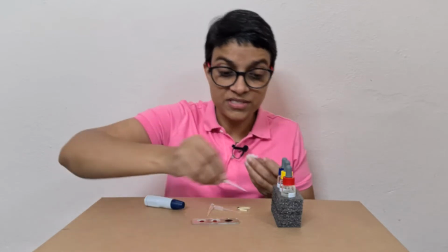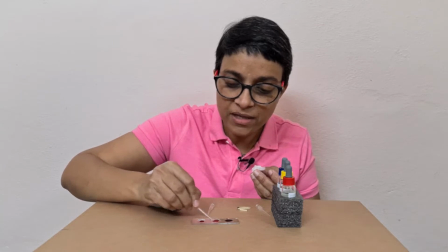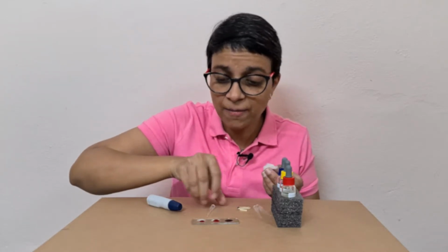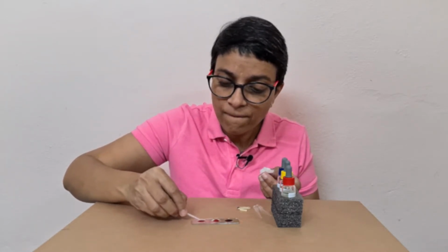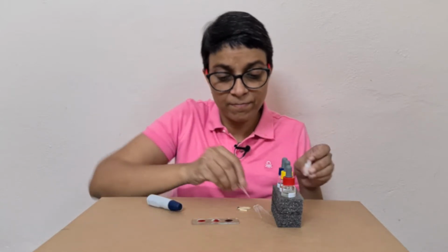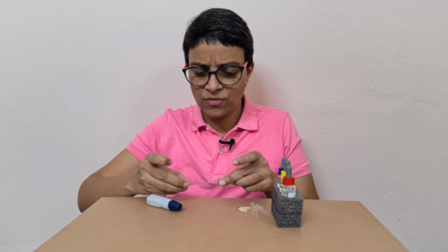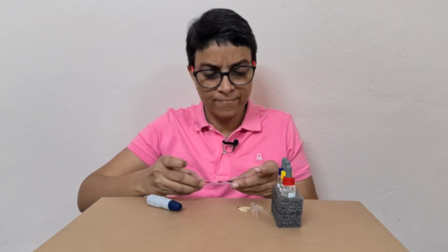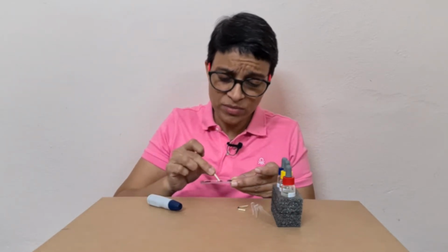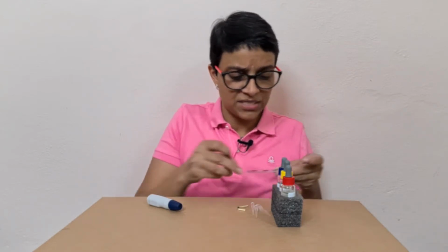Mix, discard, so that there is no mixing of the antibodies. Mix, discard. Discard. Gently swirl it for a minute. Allow it to react. Now, because I don't know which one, the tip I use to mix this is sitting very stiff, so I'm just making sure that it mixes well.